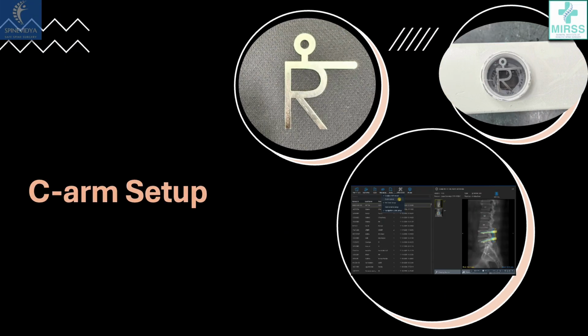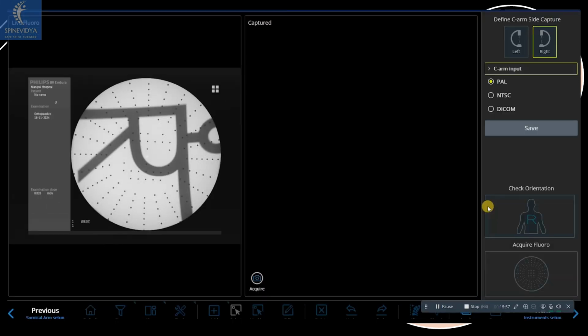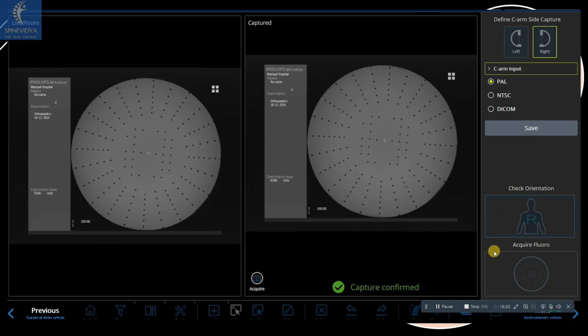The Ironman marker assists in C-arm setup by establishing the craniocaudal and right-left orientation. After verifying the C-arm tube orientation, no further software correction of the C-arm image is allowed. If the C-arm is accidentally rotated, the robot software permits reorientation. The video shows the process of registration and reorientation of the C-arm Ironman images.